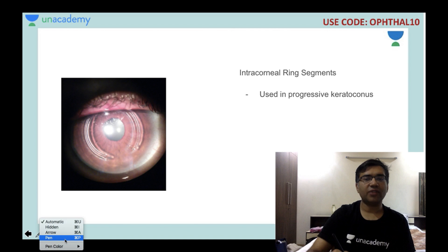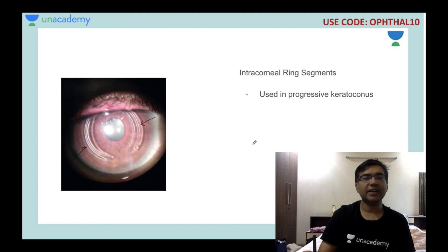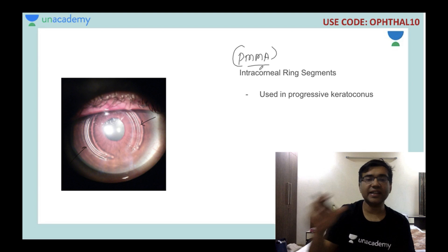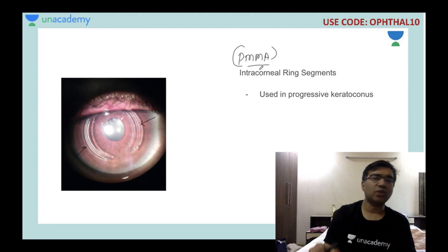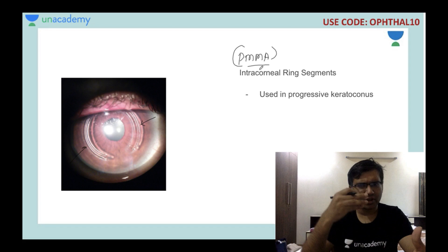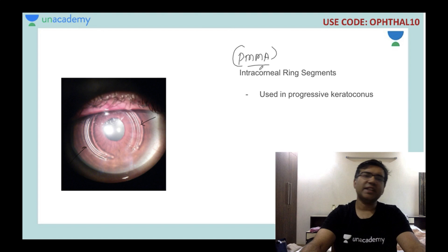This is an intracorneal ring segment, called INTACS — used in progressive keratoconus. These are made of polymethylmethacrylate. Not only do they help halt progression in keratoconus, they can also decrease the total refractive power of the patient. Patients with very high amounts of keratoconus and rapid progression get very good relief from these intracorneal ring segments.